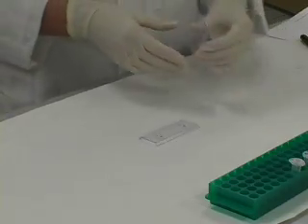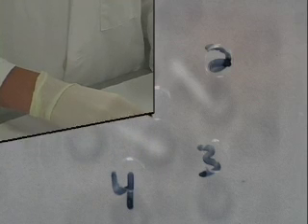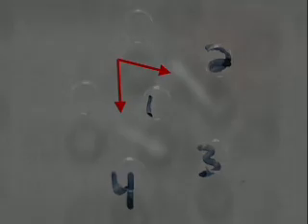The plate is then left overnight at room temperature. The next day, the analyst observes the plate for precipitin bands. A positive result is shown by precipitin bands forming a continuous arc of convergence between the antiserum well and the sample well.